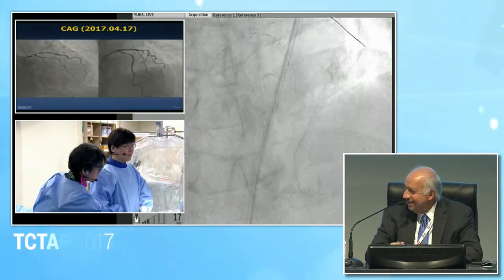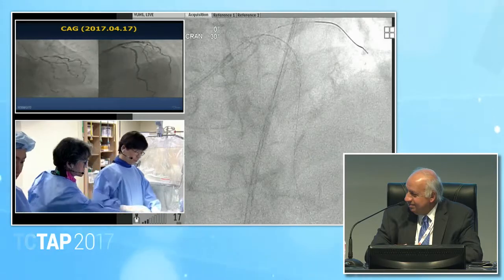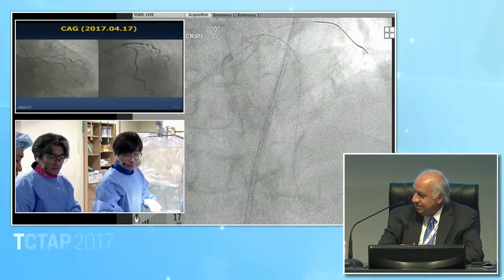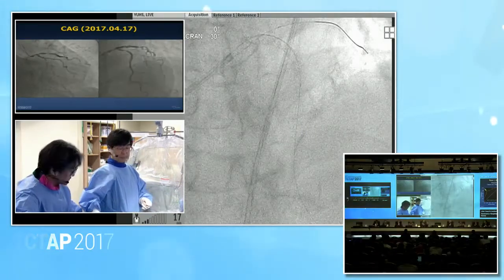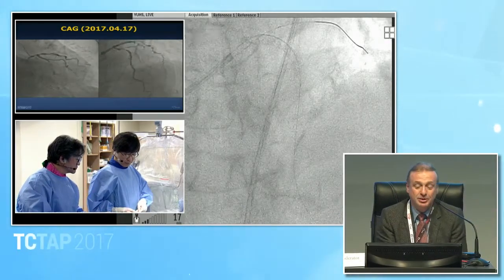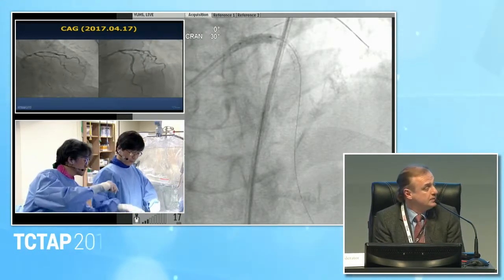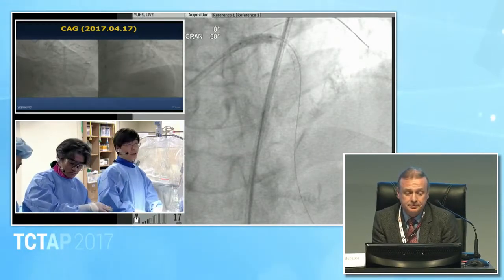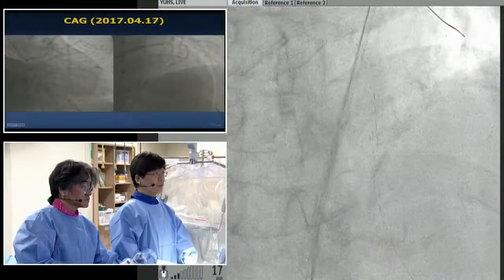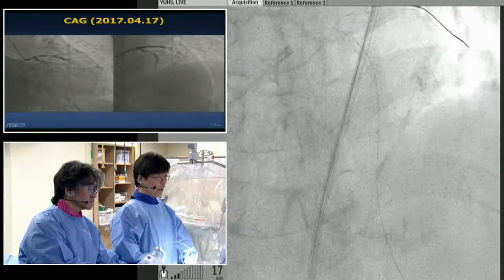I can say I have 20 years experience with left main, and I say the same as what you said, no. I had a couple of really ostial restenosis, but of course it's really very rare, and I agree it is practically impossible to cover. Okay, let's evaluate the stenting procedure with the IVUS. If there is something wrong or an unsatisfactory finding, we will do the next step.